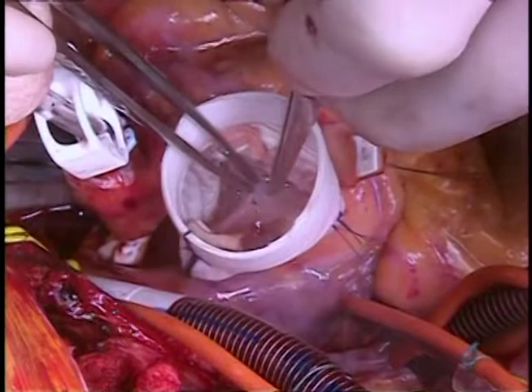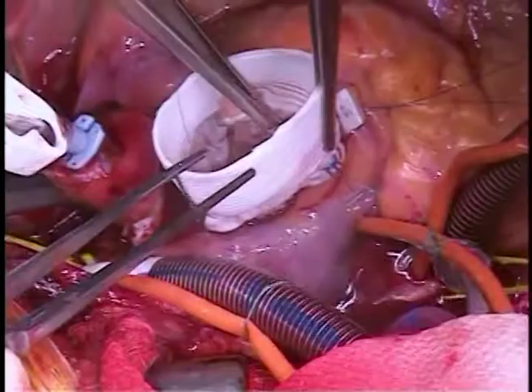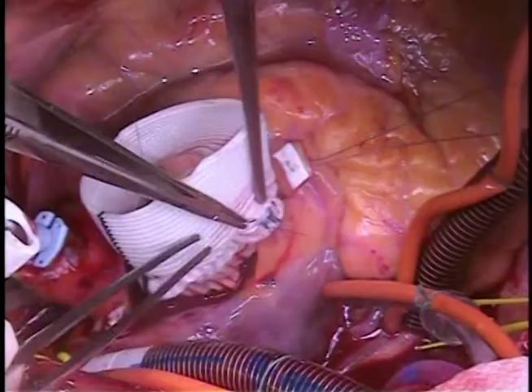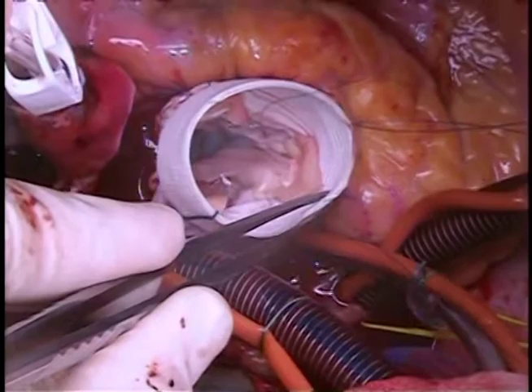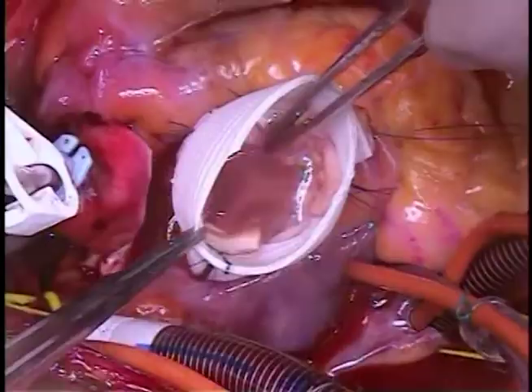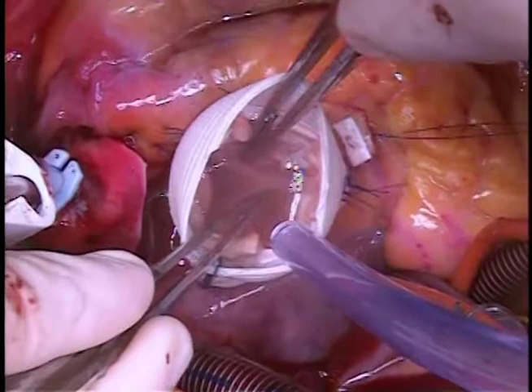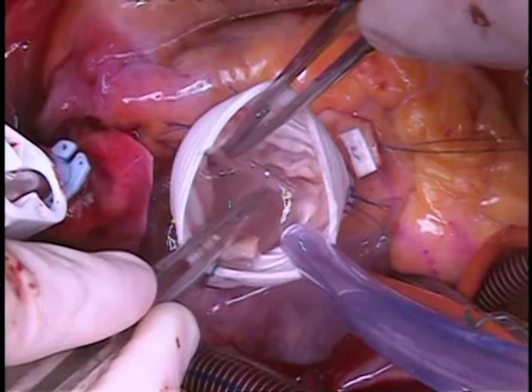You can test the valve with saline, which also gives you perspective on leaflet coaptation. If there's any question you can address it at this point. Here you see that the right coronary leaflet is a little bit longer and tends to fall into the valve, unlike the others. Thus we placed a horizontal mattress suture at the leaflet insertion point near the top of the commissure to stretch the leaflet out by about two millimeters. This was just enough to cause the leaflets to line up well. We used a small pledgeted 5-0 prolene for this.